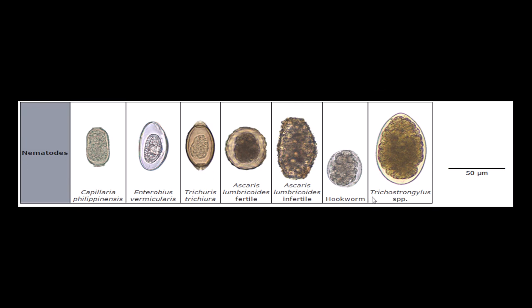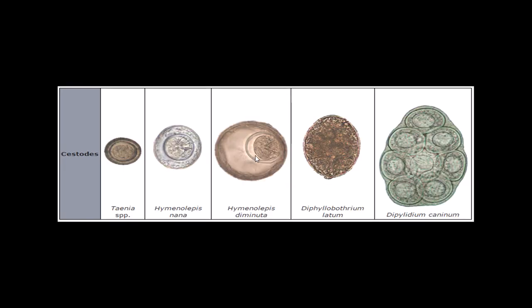And the Strongyloides stercoralis, for example, some of the nematodes can also be seen by stool analysis. So in doing a stool analysis, you can identify the type of the parasite, whether they are roundworms or a tapeworm, or some of the schistosomes can be identified by doing stool analysis.